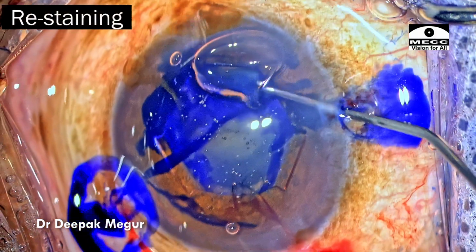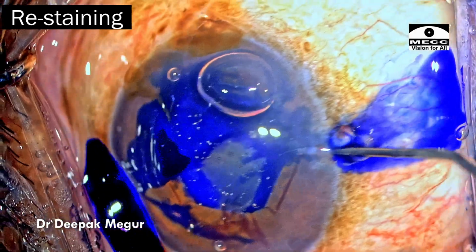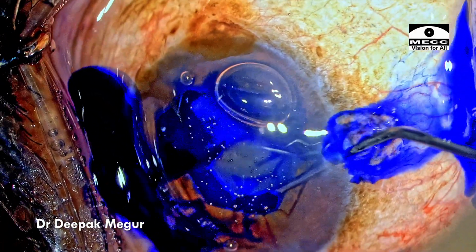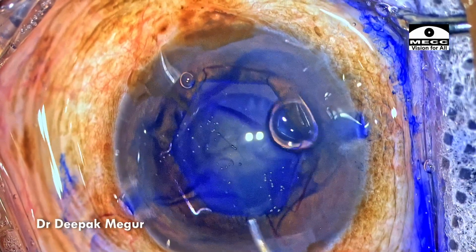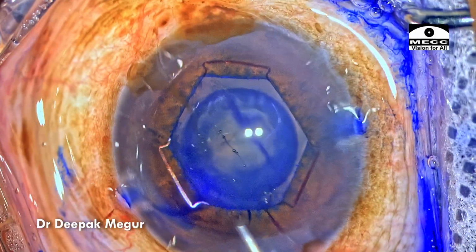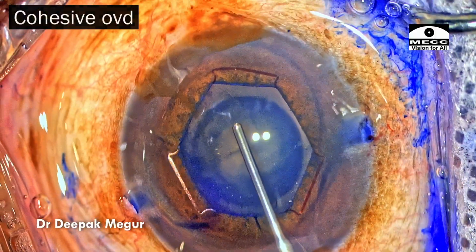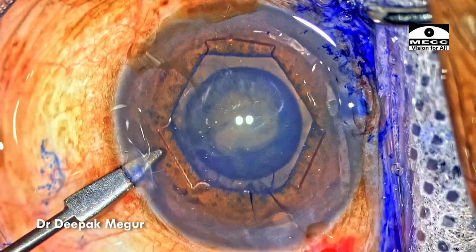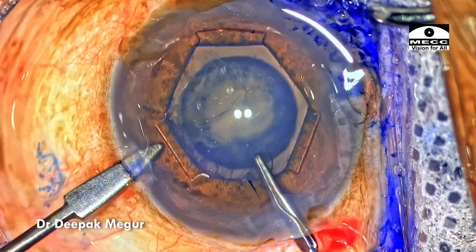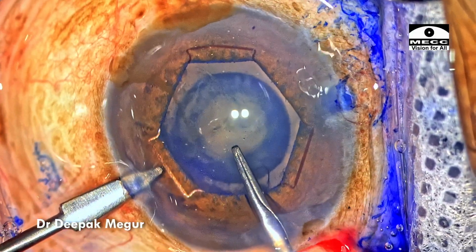Now, because some of the capsule escaped the staining, I'm attempting restaining the capsule using trypan blue. Although once the capsule has come in contact with OVD, it's very difficult to get itself stained, but nevertheless I thought something is better than nothing. Again, under the cover of OVD, the globe is stabilized with my second instrument. I'm going in with the capsular forceps and I just try to puncture it.